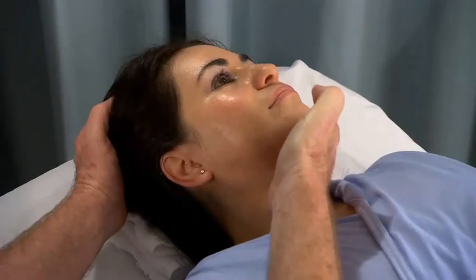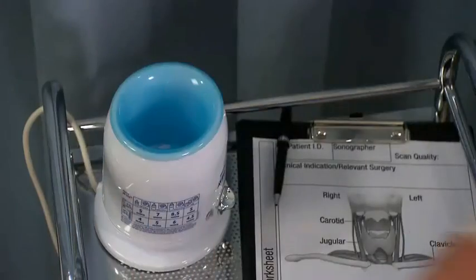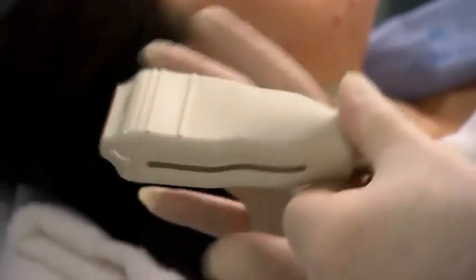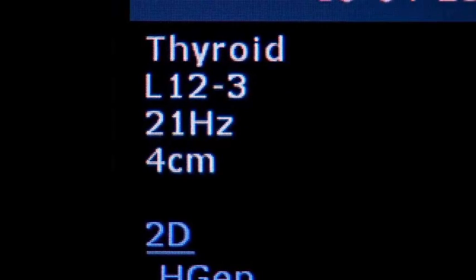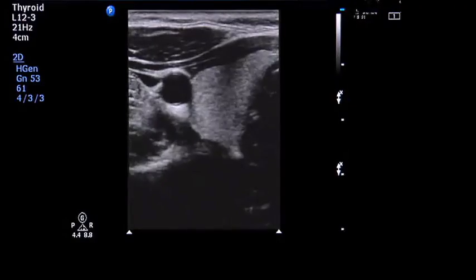Turn the patient's head away from the side being scanned to increase the visibility of each lobe of the thyroid. Expose the neck and apply gel to the anterior neck region from the sternal notch to the mandible. Select the high frequency linear broadband transducer and confirm the correct transducer selection preset.